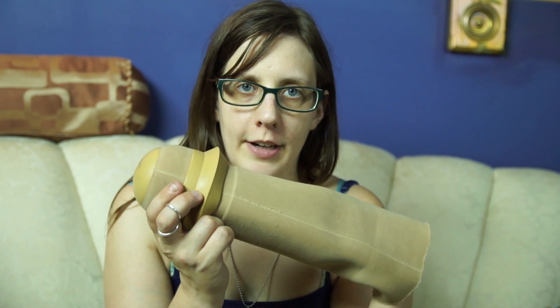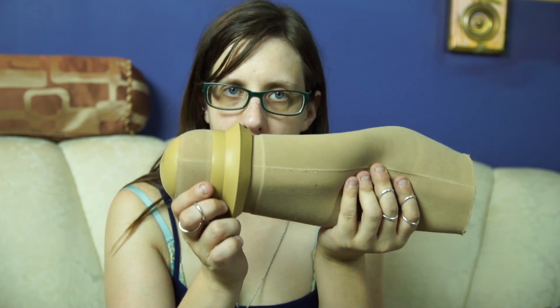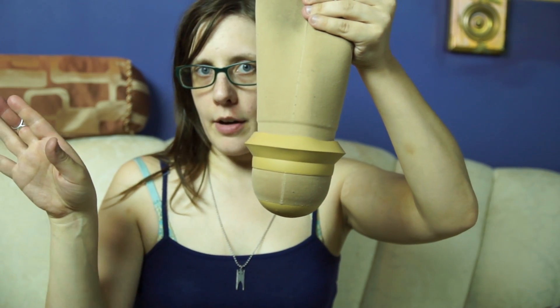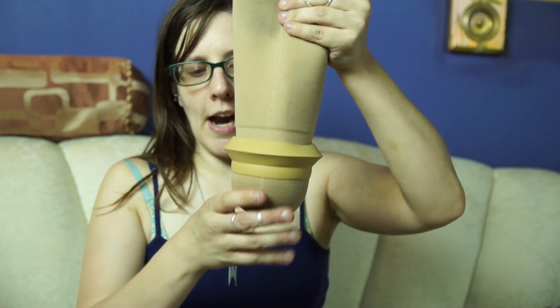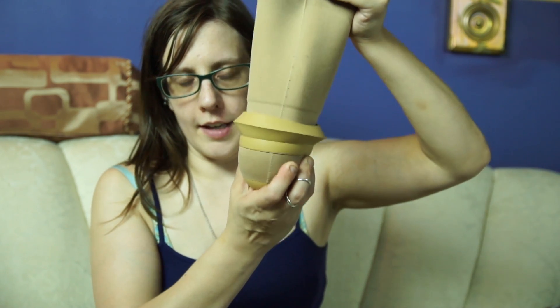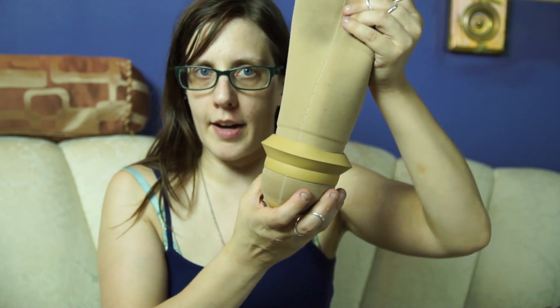The other common type of liner is a suction liner. The way this liner works is that your prosthetic has a one-way valve on it, so when you step down into your prosthetic, all of the air comes out of your socket, and then the air doesn't enter back into your socket. This forms a seal around your socket so that your liner cannot come back out and your leg cannot come back out of your prosthetic.